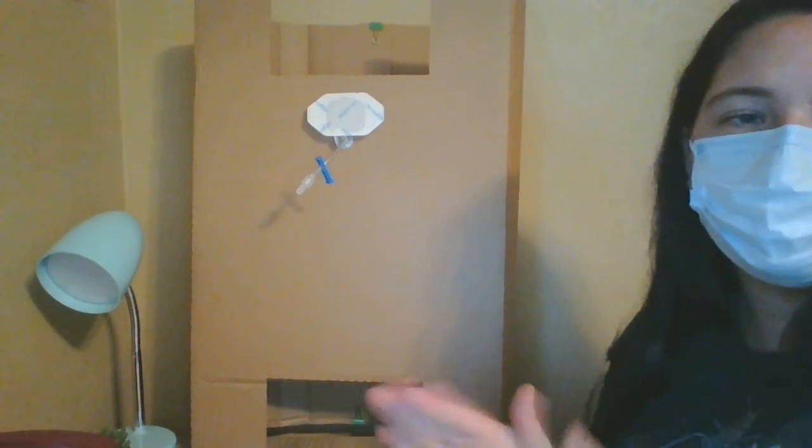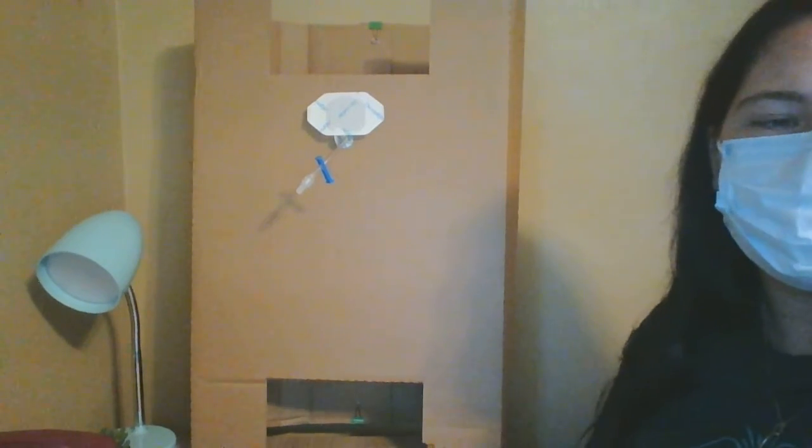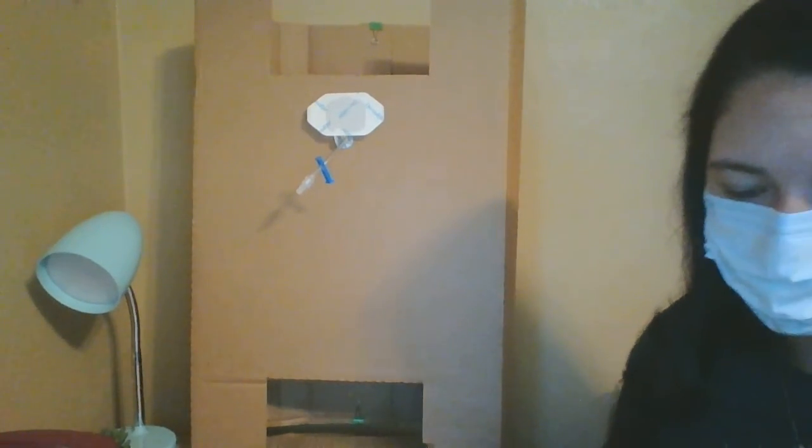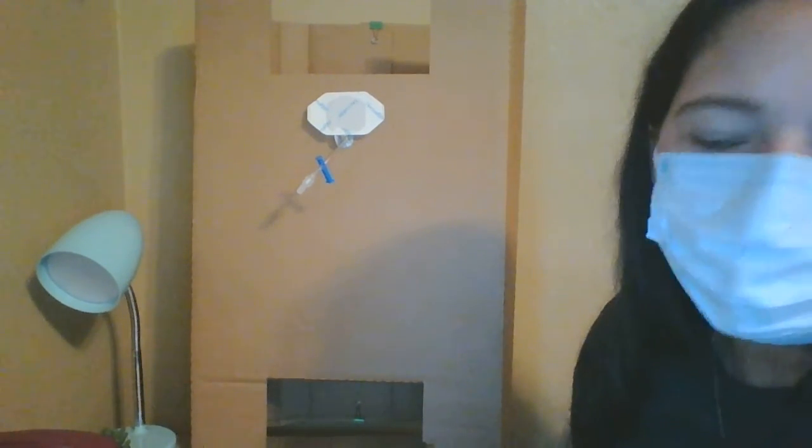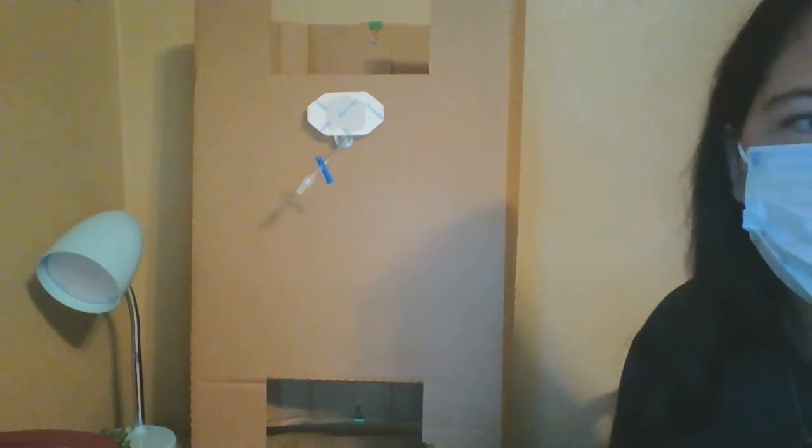And then I'll write my initials, the date, and the time on the dressing so the next nurse knows when it was last changed. So I would put all that information on here and add it to the dressing. So I make sure everything's in my bio. Take this off. And my area is cleaned up.